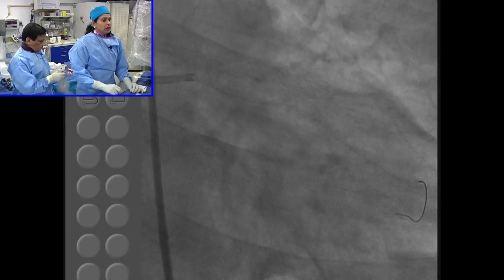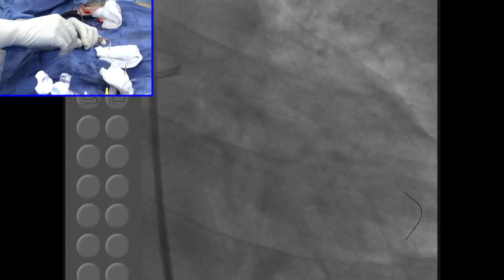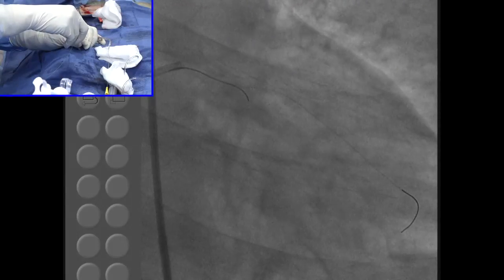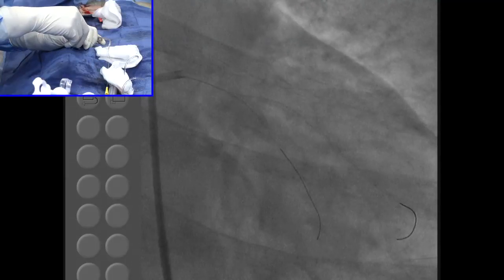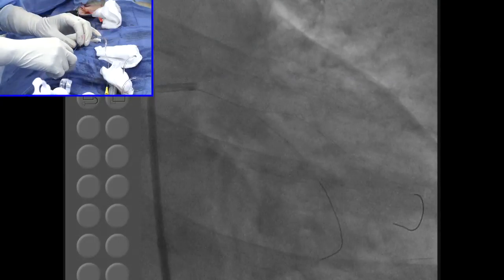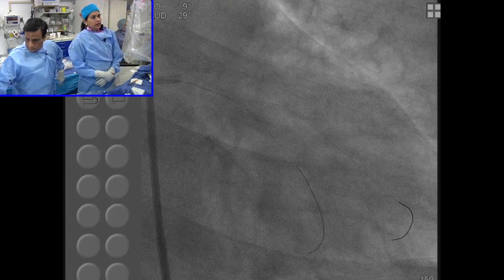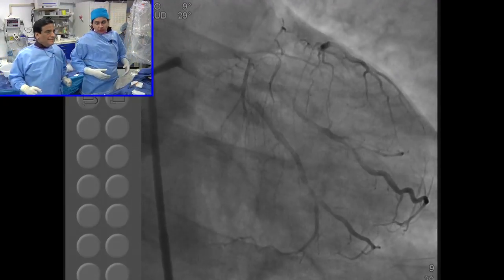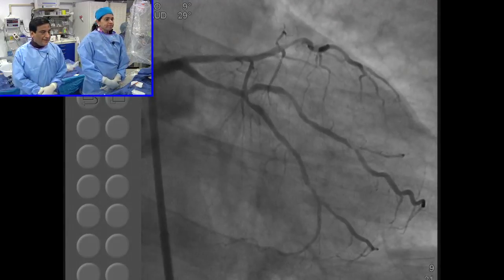If you are thinking of provisional, go with a side branch, which is usually a glide wire, which you can leave in the side branch if you're going to stent across, if your strategy is to leave the wire. So the important discussion here would be what is the stenting strategy that we want to use in this case. Definitely once we take care of the OM1 lesion, which is 90%, that's done. The question is, do we call this a simple bifurcation or a complex bifurcation? Then we can decide what's the plan. But this is a complex bifurcation by our definition study.